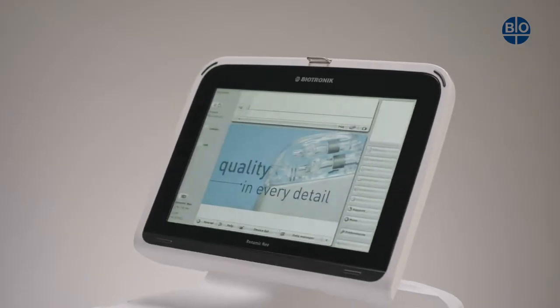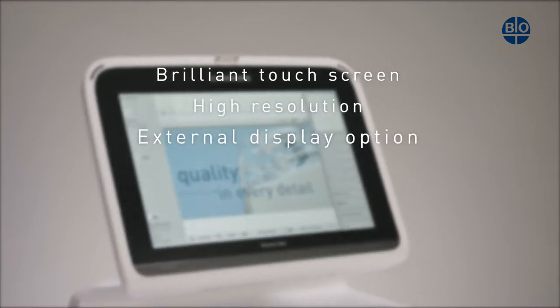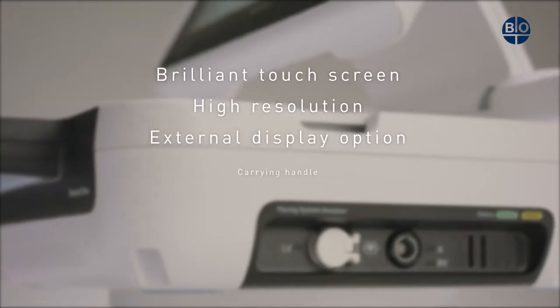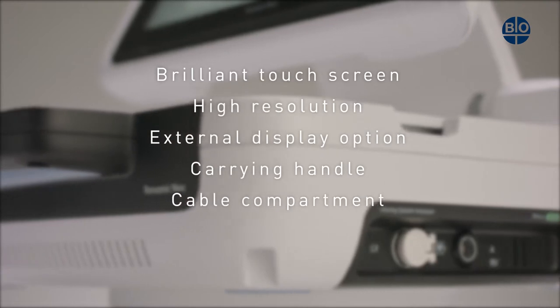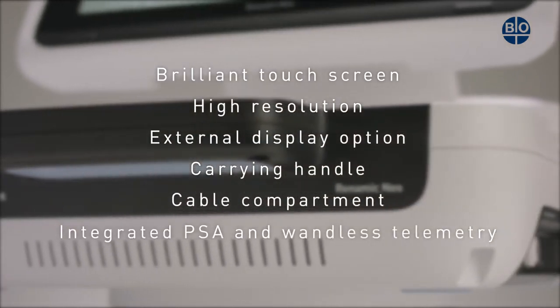Our engineers have created a smart design, which includes a brilliant touchscreen with high-resolution external display option, a handle for carrying, a cable compartment, an integrated pacing system analyzer, and wandless telemetry.